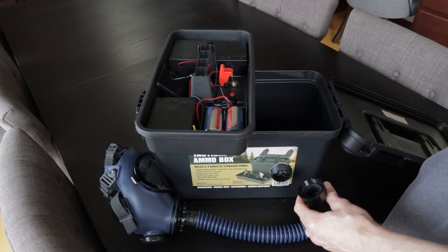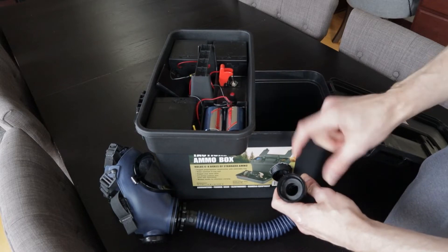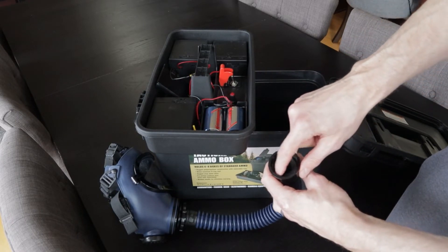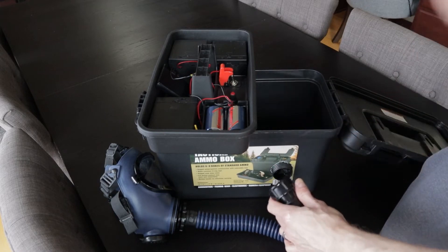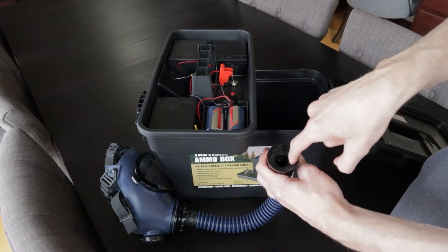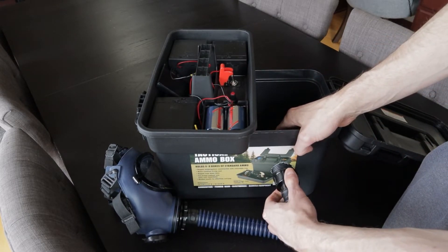My biggest worry is that with the thickness of this wall, you might not engage the seal properly. If it's not engaged, you might have air leaking in, which would be a problem. Maybe if I got a second seal to put in there, that might help. I don't know, but it does seem to clamp up pretty good.